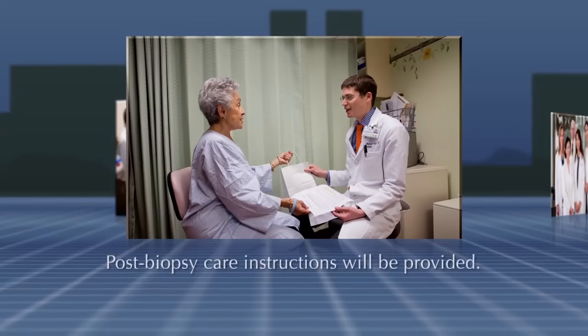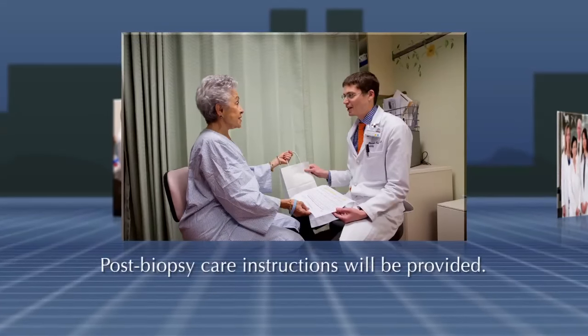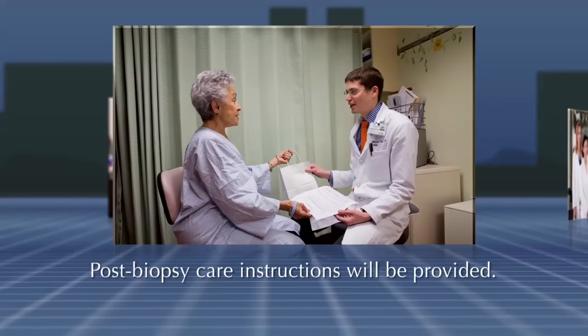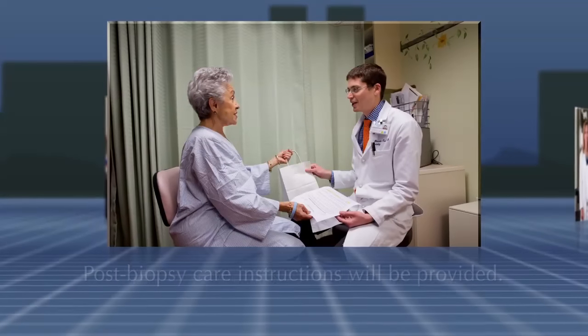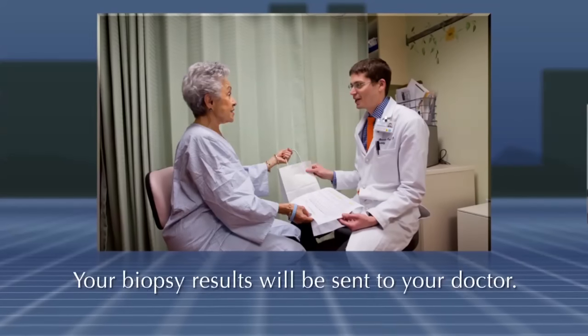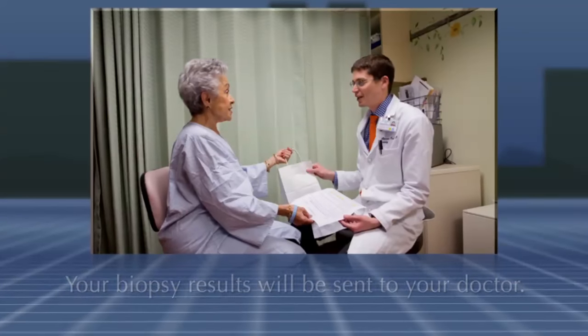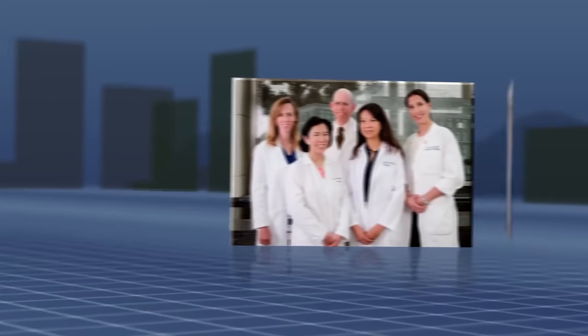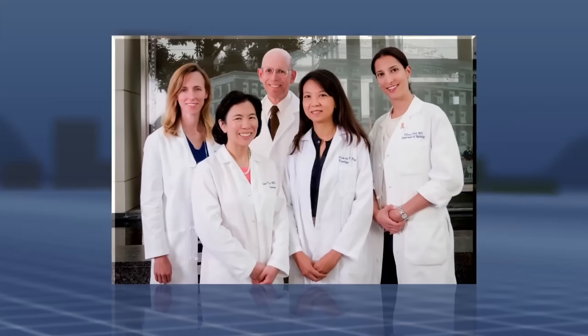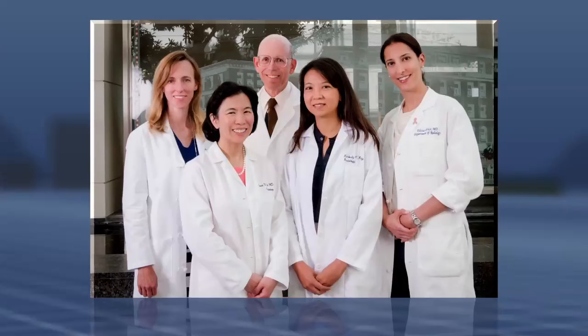After your mammogram, your doctor will speak with you to make sure you are feeling well and to answer any additional questions you may have about the procedure. Post-biopsy care instructions will be explained, such as keeping the biopsy site dry for 24 hours, and you will be given the instructions in writing to take home with you. Your full visit will likely take more than an hour, and your biopsy results will be sent to your doctor, who will contact you. The doctors at UCSF Women's Imaging are committed to doing everything possible to ensure that you are safe and comfortable, and that you're an informed participant during your biopsy.